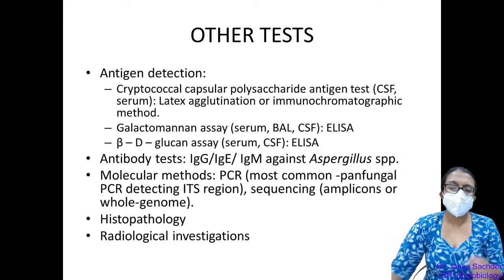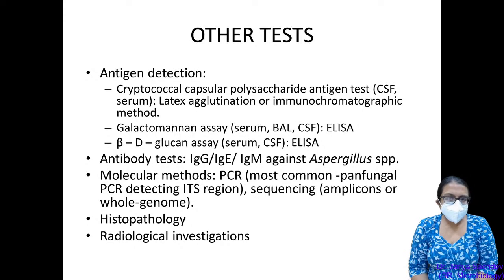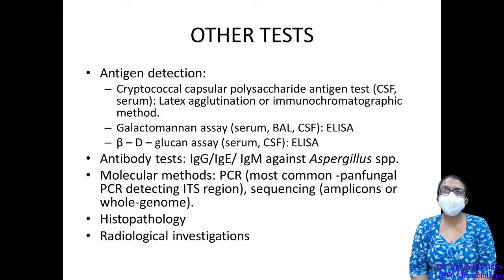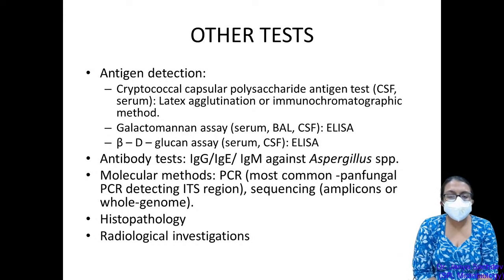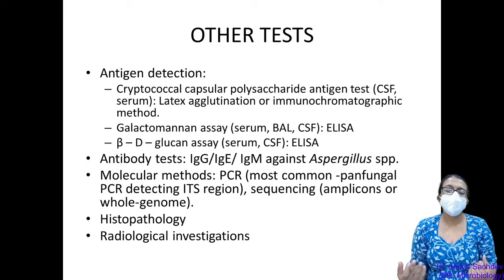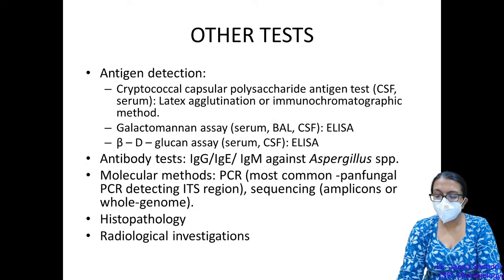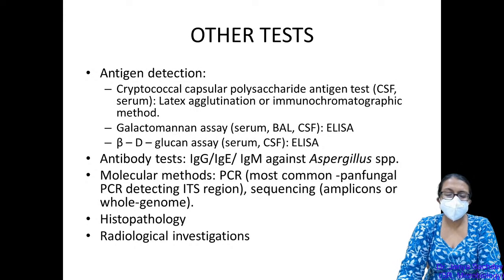There are, of course, certain other tests which are now being offered in mycology. Earlier, culture was the only method to detect fungal infections. Now, because there is an increased incidence and importance of fungal infections, we're realizing that with patients coming in at an early stage of infection or patients coming in partially treated from elsewhere, fungal culture may quite often not be giving us results. So we need better methods of diagnosis. So we need to look for things like antigen detection.